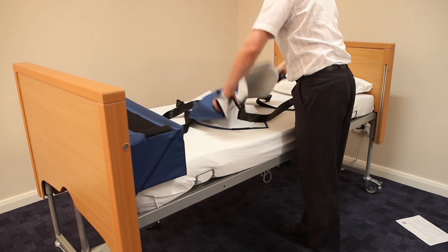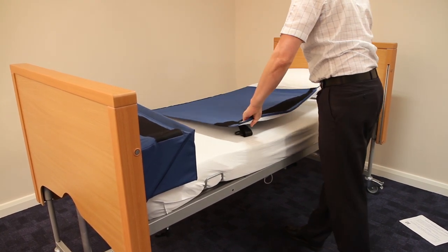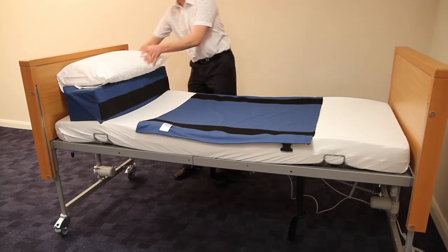Lay the draw sheet over the mattress, velcro side up. Position the draw sheet in the optimum place for the patient. Then thread the straps under the mattress.